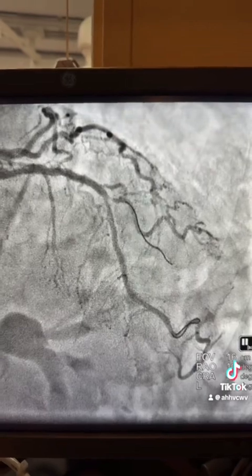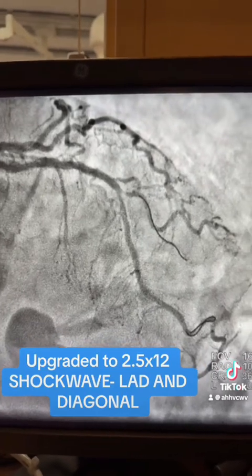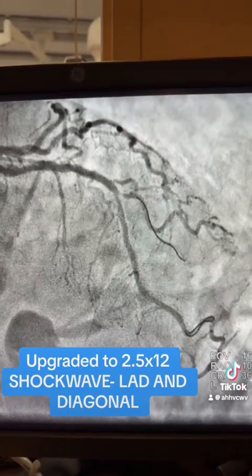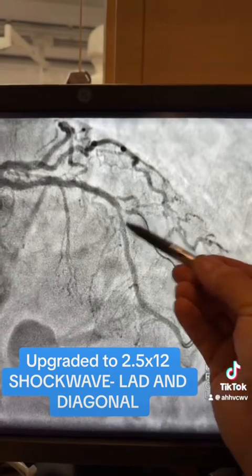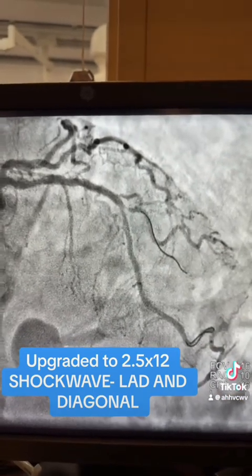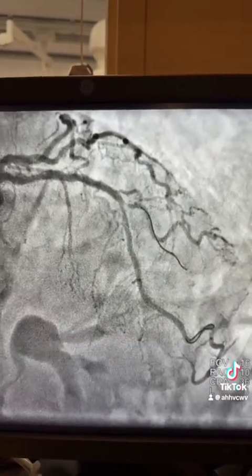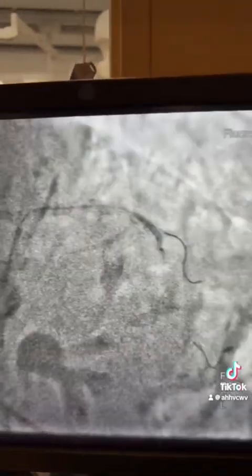I used it for the diagonal and for the LAD. Here is the 2.0 balloon in the diagonal, then use the shockwave balloon — shockwave balloon for both the LAD and the diagonal.